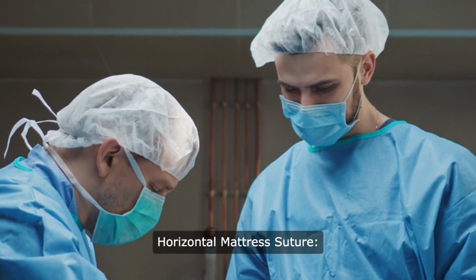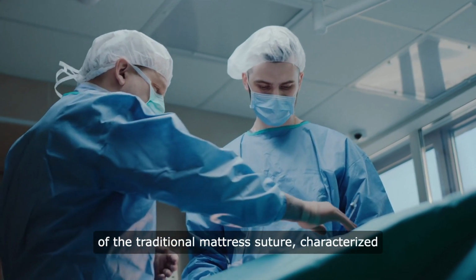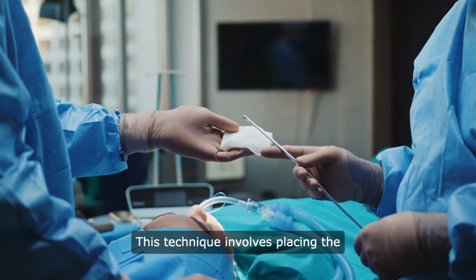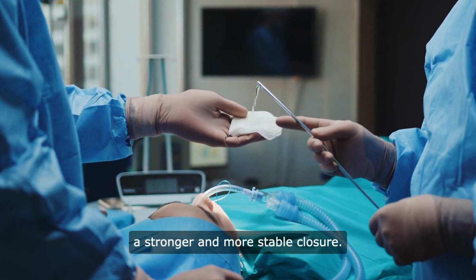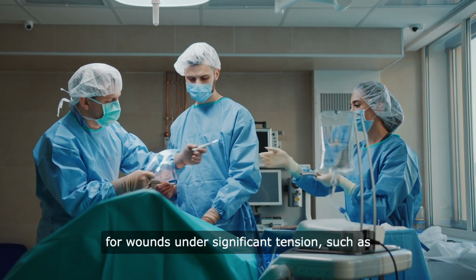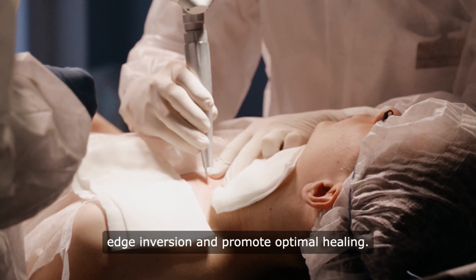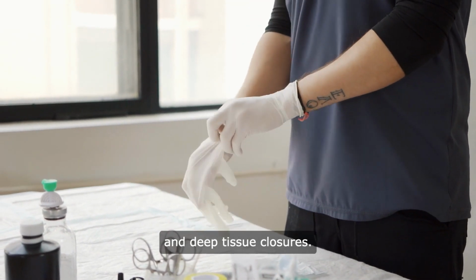5. Horizontal mattress suture. The horizontal mattress suture is a variation of the traditional mattress suture, characterized by its horizontal orientation. This technique involves placing the suture parallel to the wound edges, creating a stronger and more stable closure. Horizontal mattress sutures are beneficial for wounds under significant tension, such as scalp lacerations, where they prevent wound edge inversion and promote optimal healing. They are also used in tendon repairs and deep tissue closures.